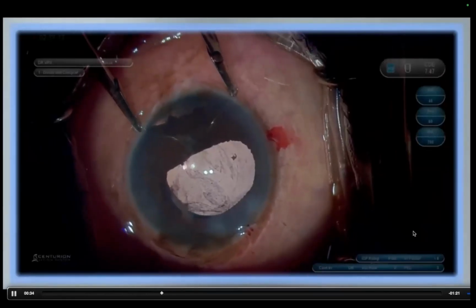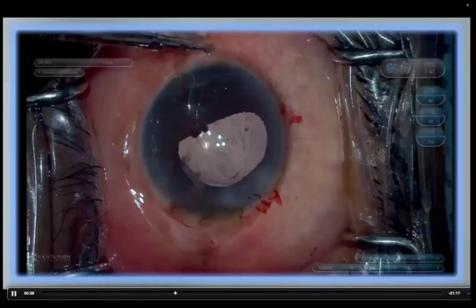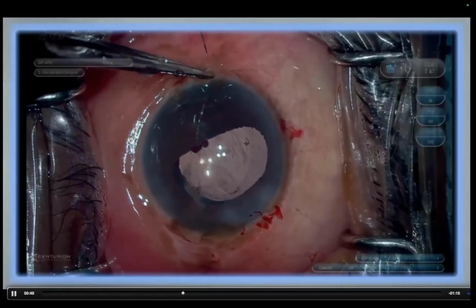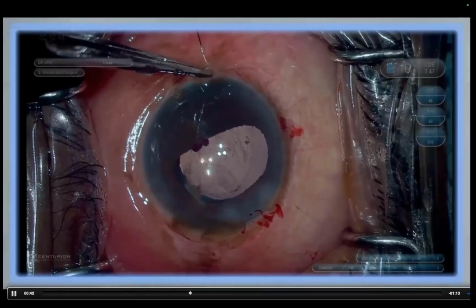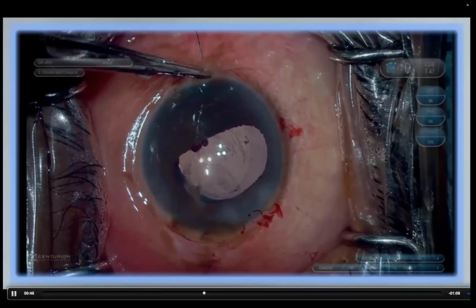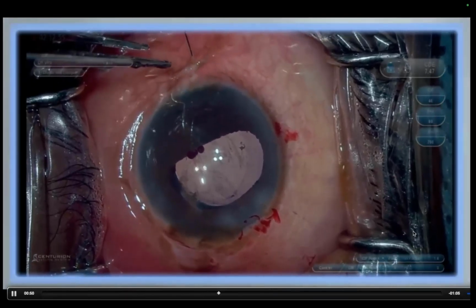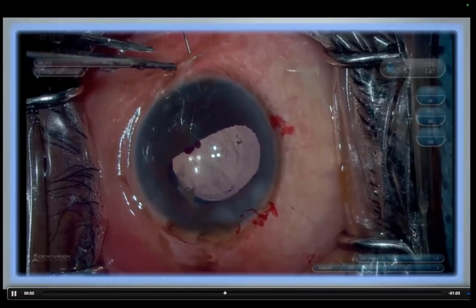The extent of the iridodialysis is marked, and where we intend to fixate is also identified. In a similar fashion, move the conjunctiva and Tenon's radially before you do the sclerotomy. Here, the positioning of the sclerotomy is going to be at the level of the iris plane. So wherever the iris plane is on the opposite side, you choose the same distance from the limbus.